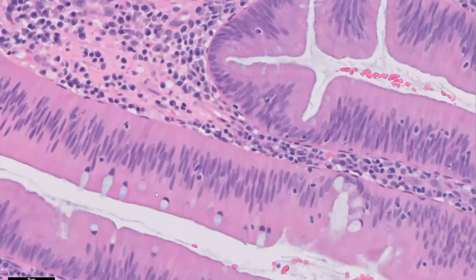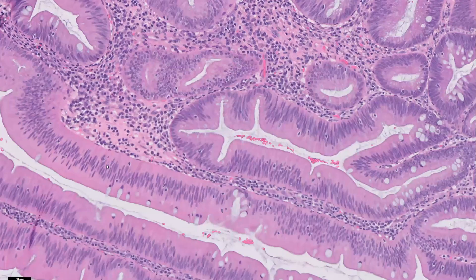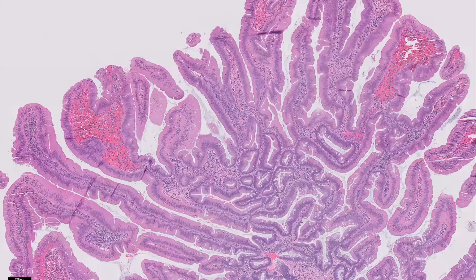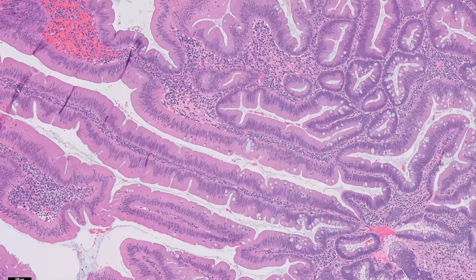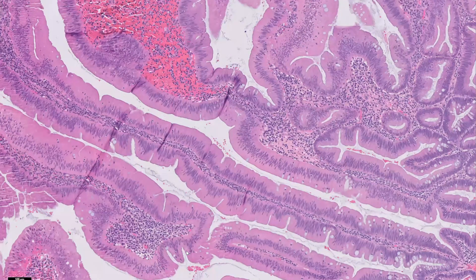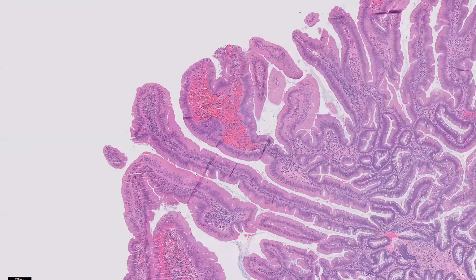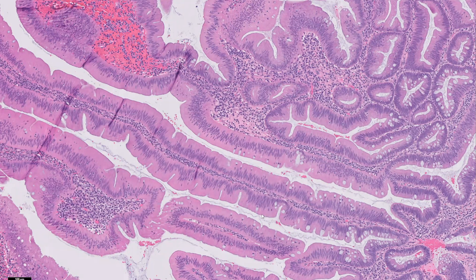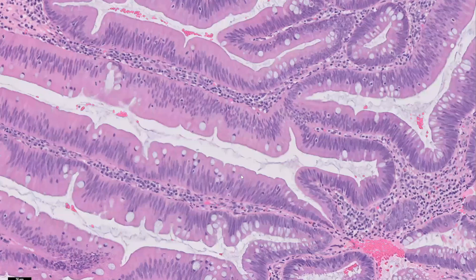Whereas in the traditional serrated part, you can see the basement membrane — you can actually see the little fine collagen of the basement membrane, and the penciled nuclei kind of come off the basement membrane. Just having those three features, you can call this a traditional serrated adenoma. A helpful — though not technically defining — feature is called ectopic crypts. Basically, looking at a true villi, you can see there's budding happening along the length of the villi, forming a crypt-like structure along the villus. These are ectopic crypts.